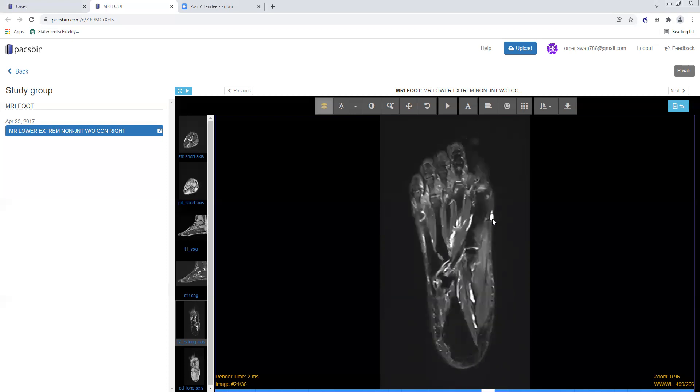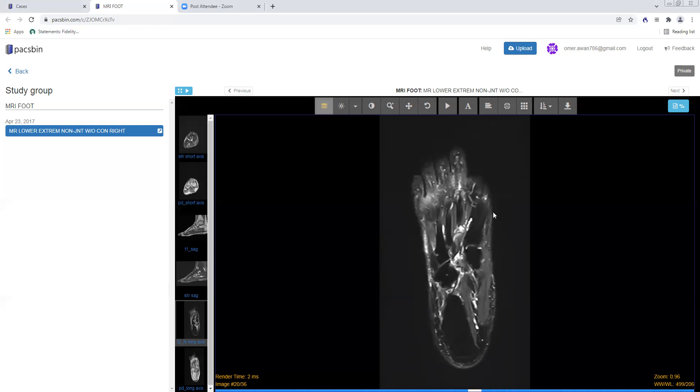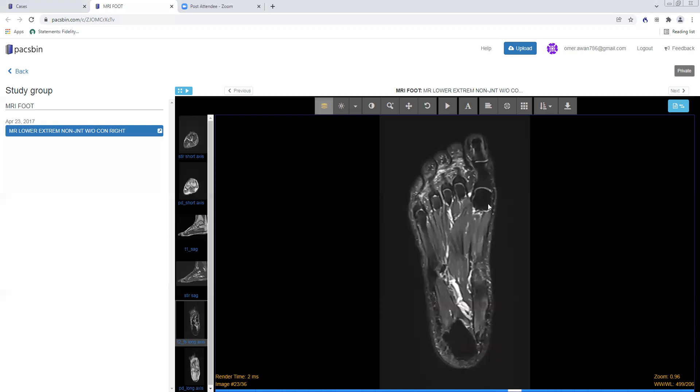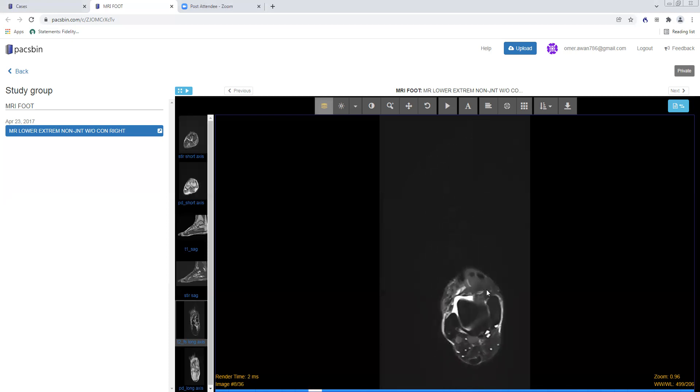This patient does have a multi-lobulated ganglion cyst adjacent to the first metatarsal neck — that's an incidental finding. Typically patients won't have that, but ganglion cysts in the foot are actually very common. So those are the most important things we look at on the axial long axis plane.